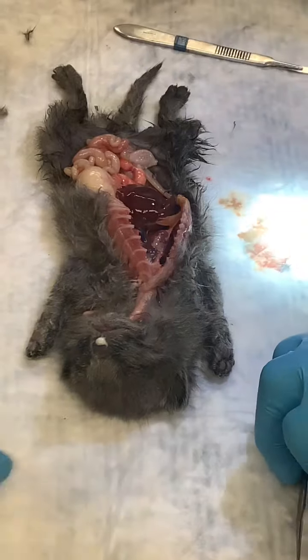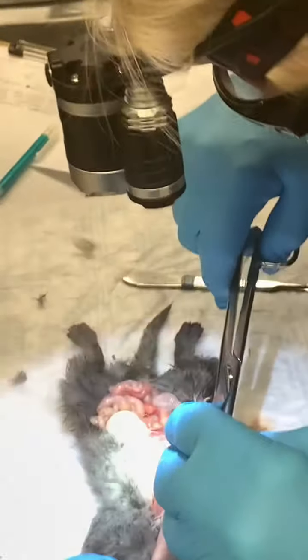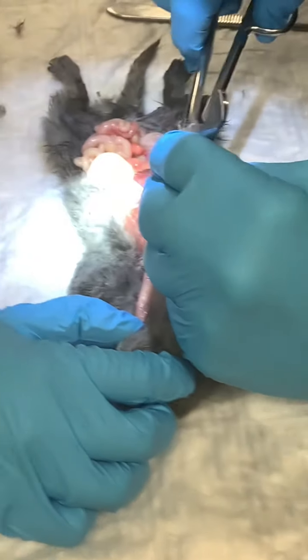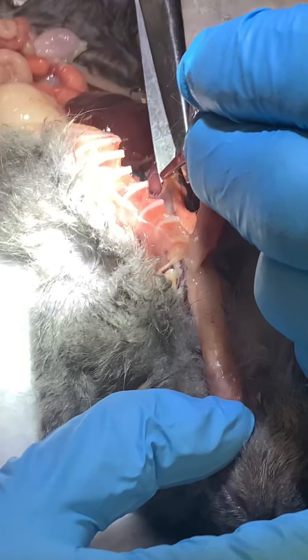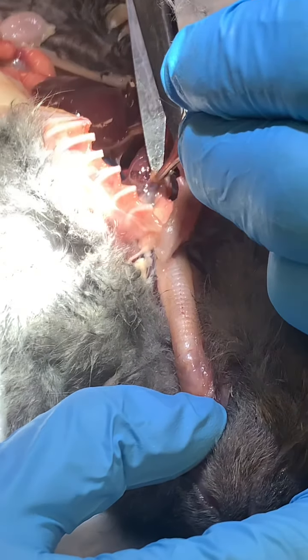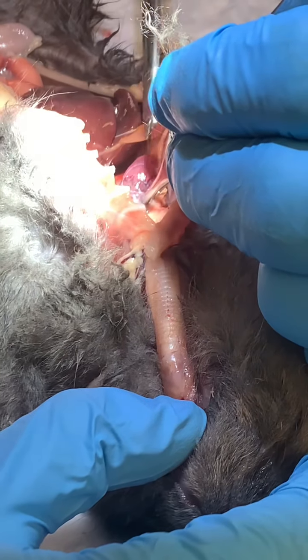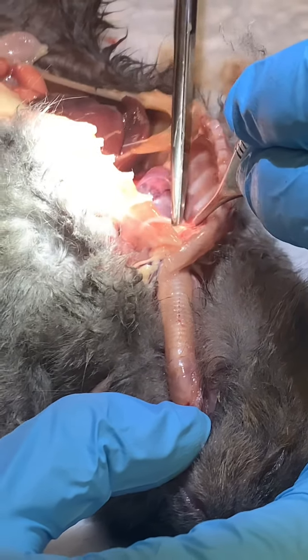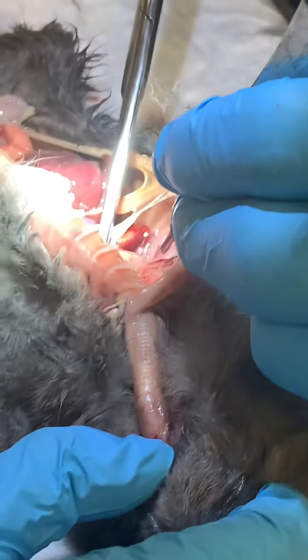Let me see here. So this is the pericardial sac. I'll open that up a little bit. I don't think that's pus. I think that's part of the thymus, because it's a big tissue through here, and then it recedes as they mature.